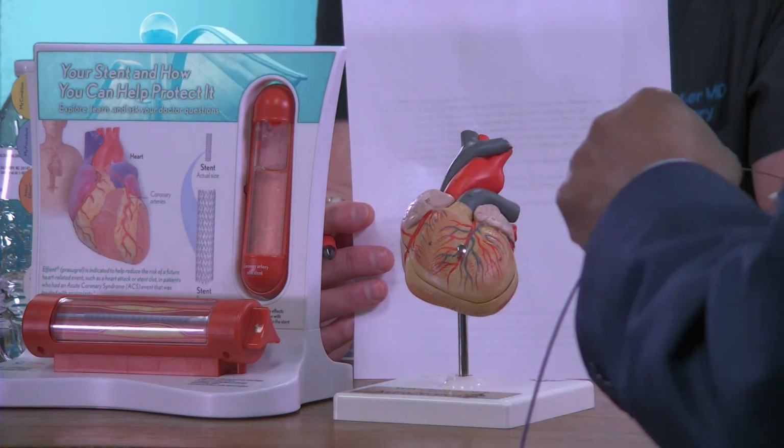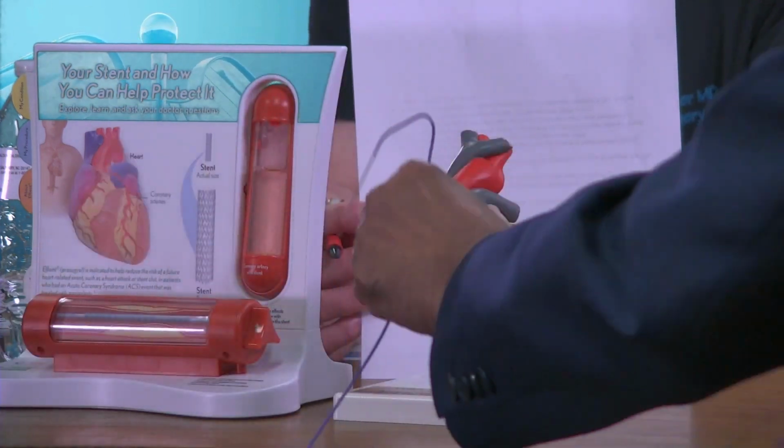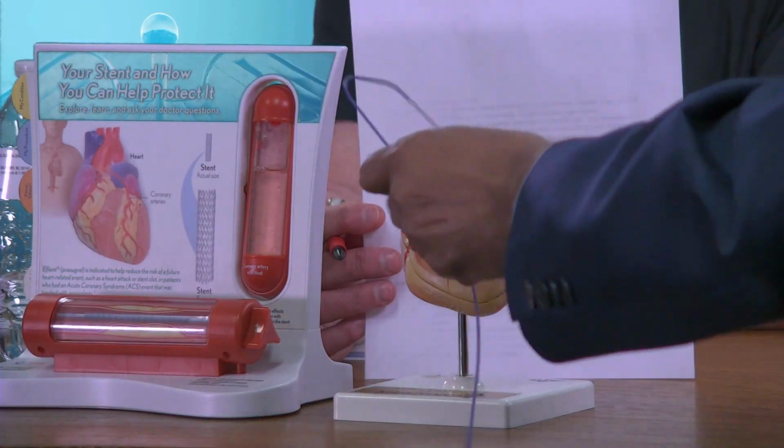Is there a turn? Is it straight? Is it curved? You know, and so there's the catheter that's inside the vein now. Show us sideways. Show us your hands blocking it.